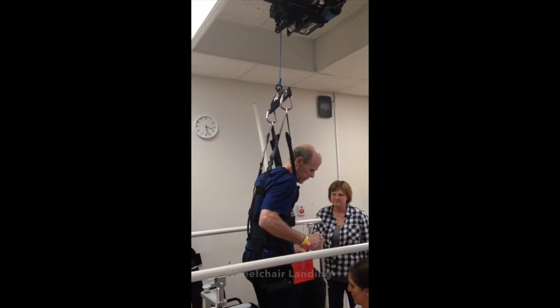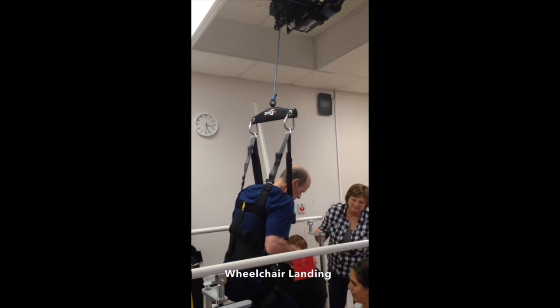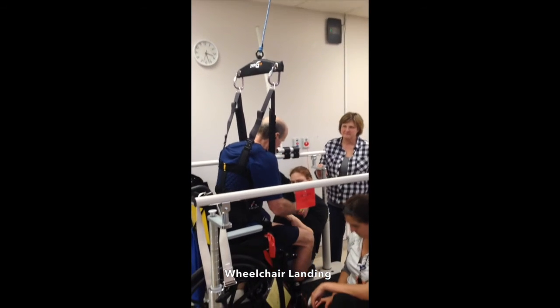Every Zero-G Lite comes with a wheelchair landing to safely assist patients on and off the treadmill. For more information on Zero-G Lite, please contact Aerotex.